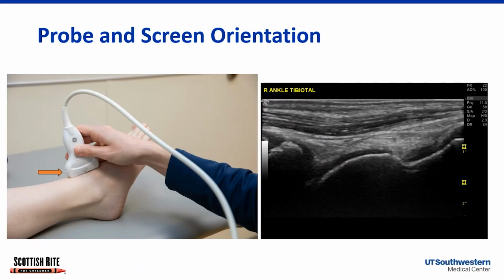I remember when I was in medical school, people talking about ultrasound and saying, oh, left side of the screen means medial or proximal. And I just could not wrap my head around that. It took me a long time. That's what they standardly do in radiology, because sonographers will often take pictures and that lets the radiologist know, hey, this is the screen orientation. But you don't have to follow those rules, okay?